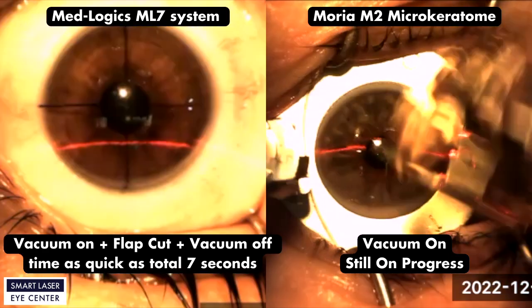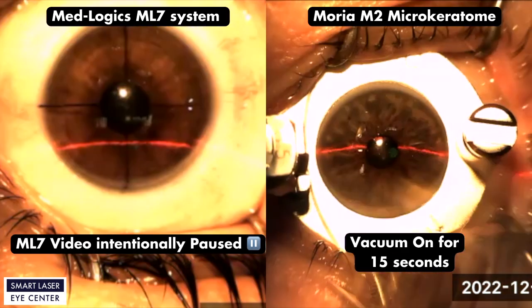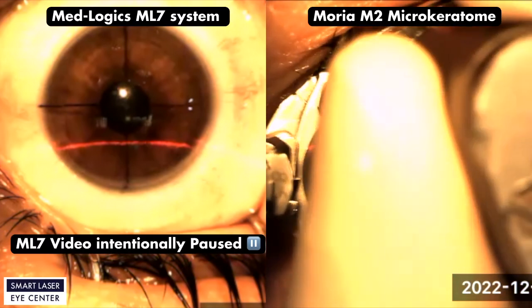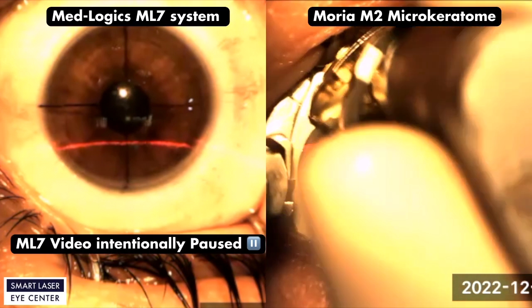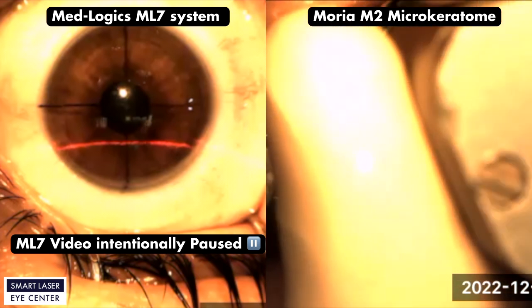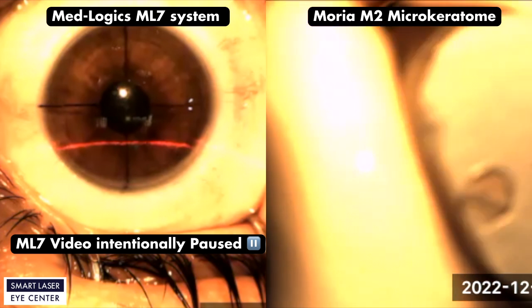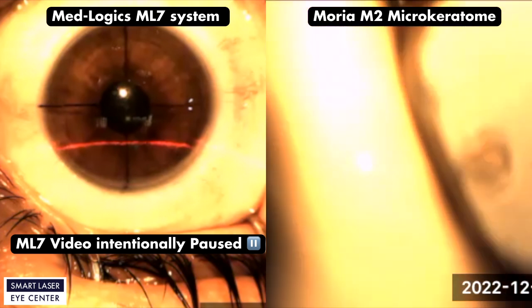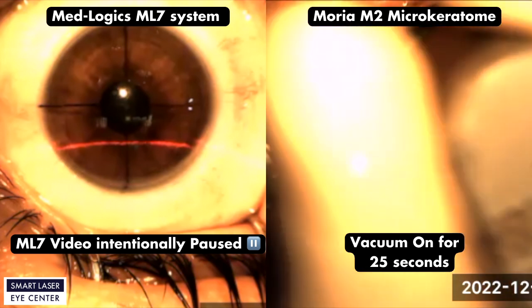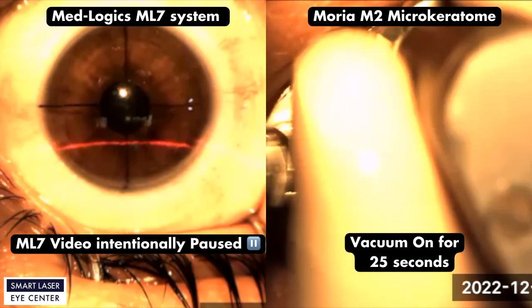The ML7 video is intentionally paused. On the right side, the Moria M2 system is still in progress to reach desirable vacuum pressure. We will continue to watch the ML7 video until the surgeon removes the Moria M2 ring. The patient eye is still under vacuum for 25 seconds, and the surgeon is still trying to mount the M2 motor onto the eye ring.